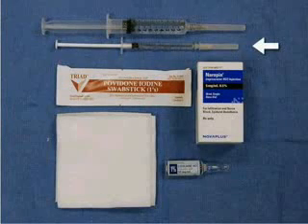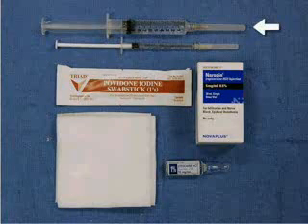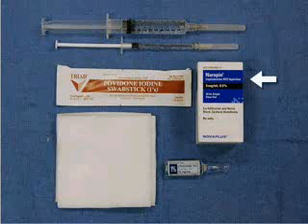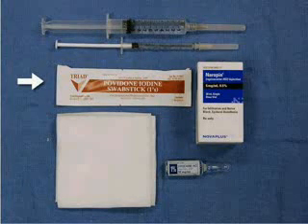Prior to initiating the saphenous nerve block, obtain a tuberculin syringe with half-inch 25-gauge needle, 1% lidocaine, a 10 milliliter syringe with 1.5-inch 22-gauge needle, 10 milliliters of the local anesthetic of your choice, gauze, and a povidone iodine swab.